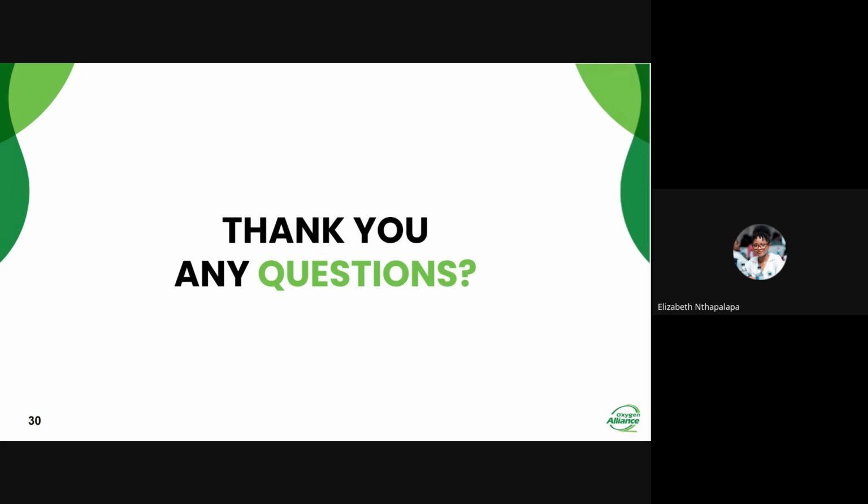There is also something in the chat, asking if it is calculated according to the number of breaths per minute. It will not be per minute because a cycle does not cover the full 60 seconds. One breath cannot take 60 seconds. It's maybe 5 seconds, one breath. So if we calculate in numbers per minute, then we are not using our units very well. I guess that is it.